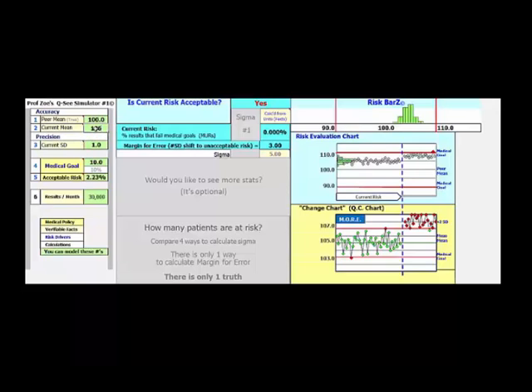What if I have a mean of 106? Well, that's a different situation. Now, only 50% of the results afterward are flagged. That's because the margin for error is 2 SD. If it shifted 2 standard deviations, the method would fail. An unacceptable risk level would exist. If it shifts 2 standard deviations, you know this from the statistics, if the new mean is 2 SDs higher, 50% of the results are above the mean, 50% are below. There's only a 50% chance you're going to detect that error. So although the risk is acceptable now, this QC process is not effective to detect this shift in the mean.